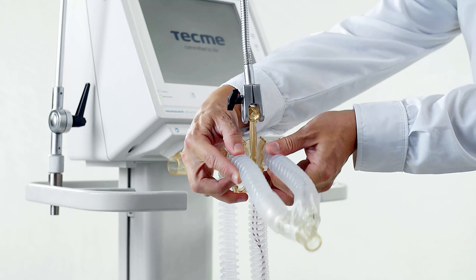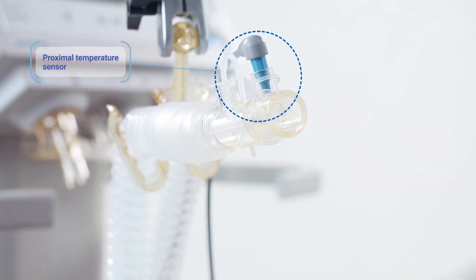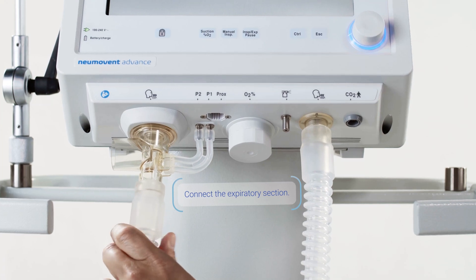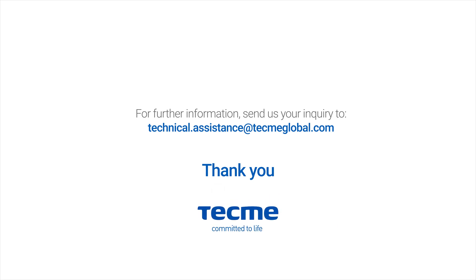Place the other end of the patient circuit in the appropriate bracket and connect the proximal temperature sensor. Finally, connect the expiratory limb of the patient circuit to the expiratory set.